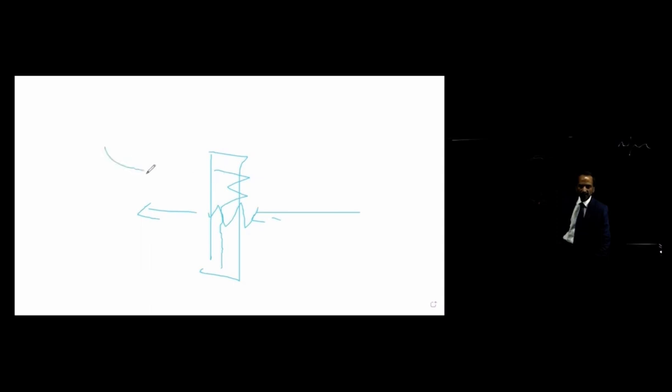So if we just put 2 electrodes here, and there's slow conduction, and say we go around the IVC or pulmonary vein in the case of the left atrium, through another scar in the right atrial free wall, we will very readily see that this could look like it's blocked. The proximal electrode will be earlier than the distal electrode if this is how we've kept the catheter.